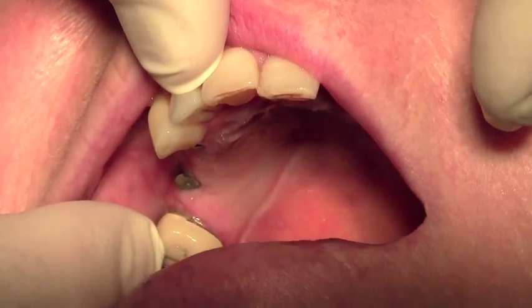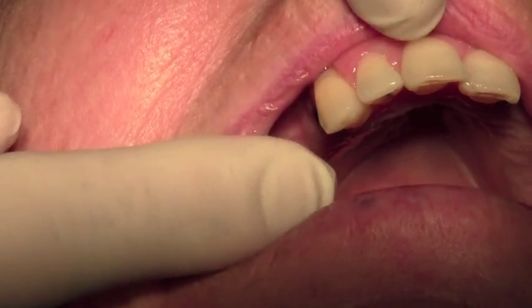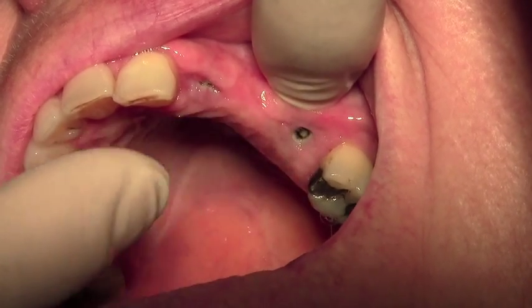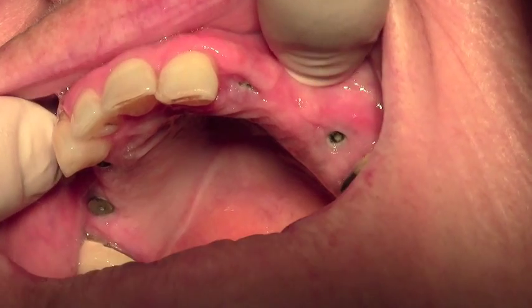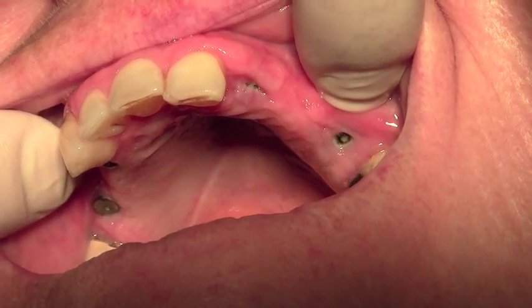Here's the case. Just turn your head a little bit away from me — you can see the two dental implants on the right side clearly with the healing caps. Turn your head this way; a little bit less easy to see on this side. We've got the left healing caps in place, and the gum is just a little bit deeper on this side. The first thing we're going to do is remove the healing caps and try the CAD-CAM milled abutments in place.